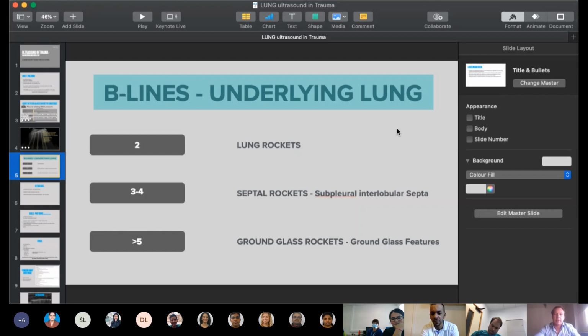So in the case I'm presenting, the patient had a lot of extravascular lung water. And while I couldn't get consent for the CT, the left side of his lung was completely whited out with no pneumothorax. So the thought was that the current went through his hand, through his body, and completely fried his left lung. And by using ultrasound and looking for all the rockets that he has in terms of B lines, how many, we decided not to do an intervention that would have had a negative impact in this patient, even though it was influencing his oxygenation and ventilation.